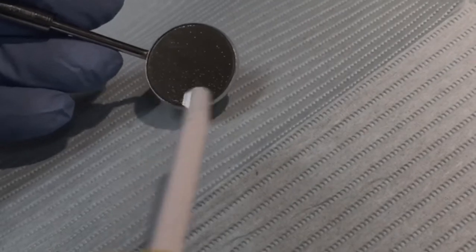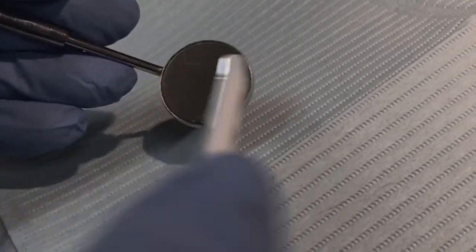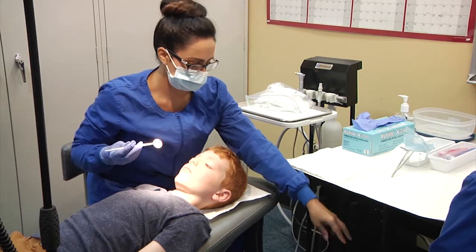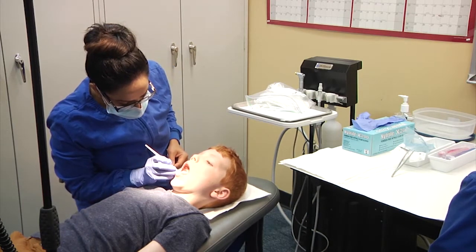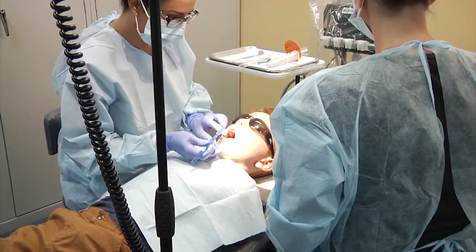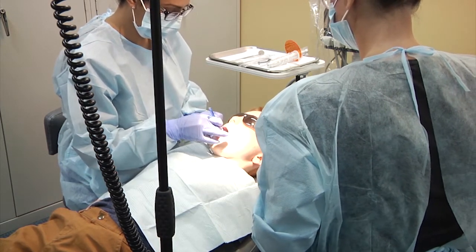You first want to check the air-water syringe to ensure there is no moisture coming through the air line. Just spray air on the mirror or on the patient's bib until you can be sure the air line is completely clear. Select the teeth to be sealed. Screening only can be conducted with one gloved hand if the un-gloved hand does not touch the patient. Once the patient situation is assessed, preparation for sealants can begin. The occlusals of the teeth must first be thoroughly cleaned with the toothbrush.